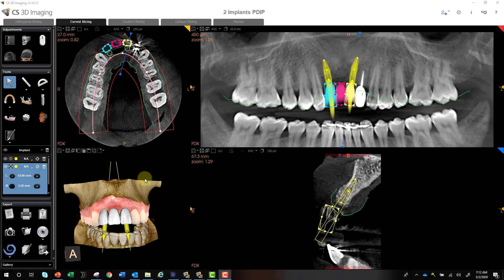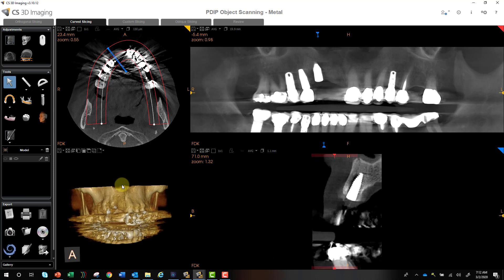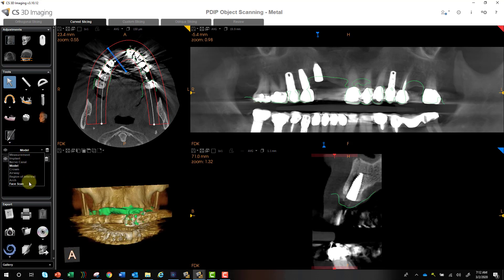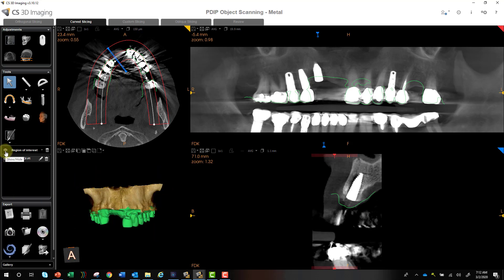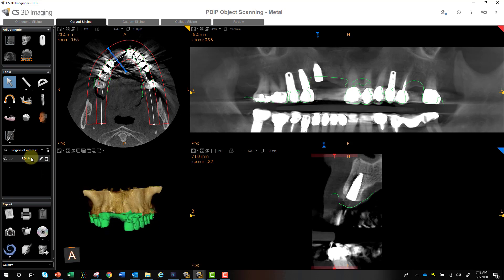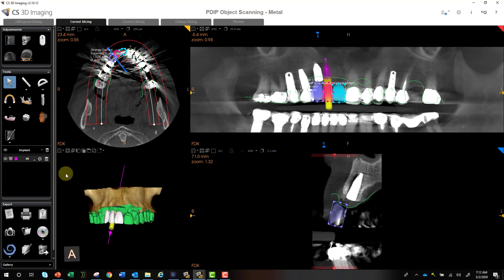Another good example of how it can be helpful to merge your impression scan and add your crowns is when you have patients with high amounts of scatter, like you can see here. In this case I've got it pretty much all planned already, just to show you the value of doing it. You can see here we've merged our model, and using this region of interest tool cleans up our scan nicely. When we add our crowns, everything is added accurately — all that scatter is out of the way — and now we can plan our implants much more effectively.